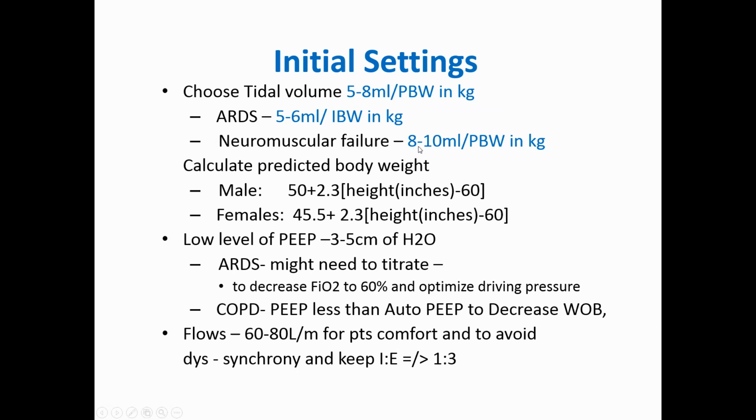And the one thing you have to always remember: people with muscular disease are almost always very hungry air-wise. So when you use very low volumes, they can't tolerate it. They just want much bigger volumes.